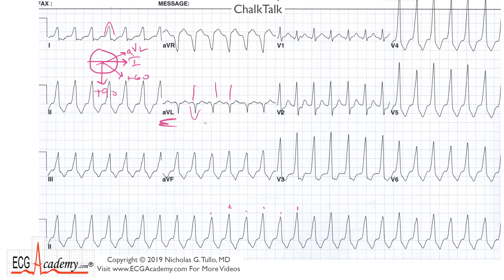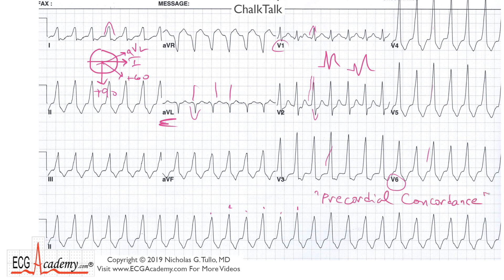In lead AVL, it doesn't look anything like a left bundle branch block. So let's look at the precordial leads and try to get a sense of if it follows any particular bundle branch pattern. In V1, it looks like it's up — could this be a right bundle type of thing? But it's really sharp with an S wave; it doesn't have an RSR prime like you'd expect for right bundle. And then V1 all the way out to V6 is all positive — they're all upgoing. That's called precordial concordance, and it's strongly suggestive of ventricular tachycardia.